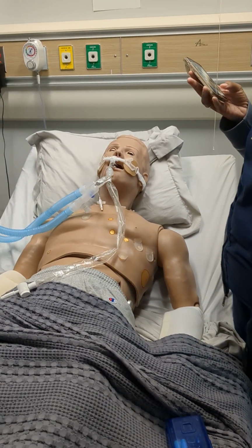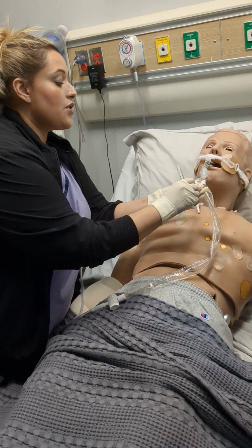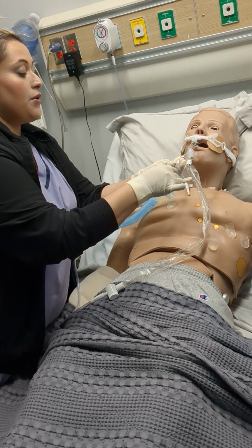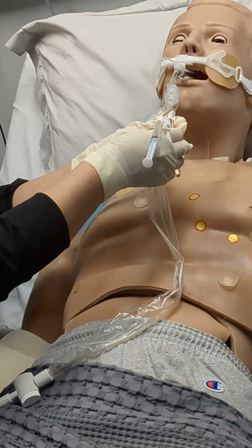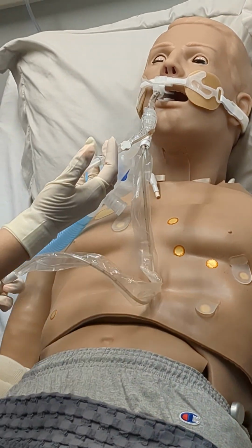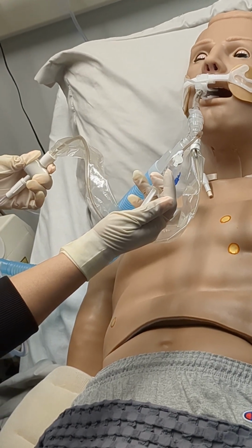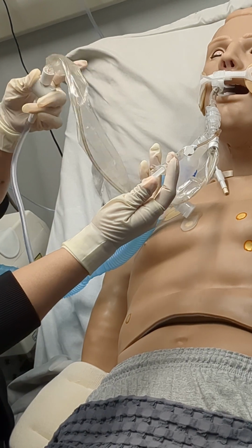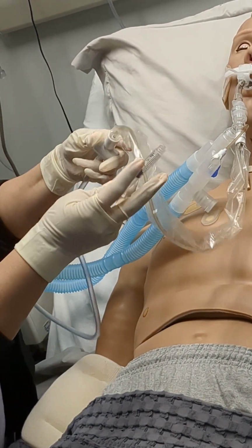You have to flush this line if the patient has thick secretion. So how do I flush it? Okay, you're gonna remove the air. You're gonna put it in here, okay? And you're going to align this Murphy eye of the suction to the saline, and you're going to advance the saline as you suction so that it doesn't go inside of your patient and drown them. So as you're pushing in water, you're sucking the water from the line.